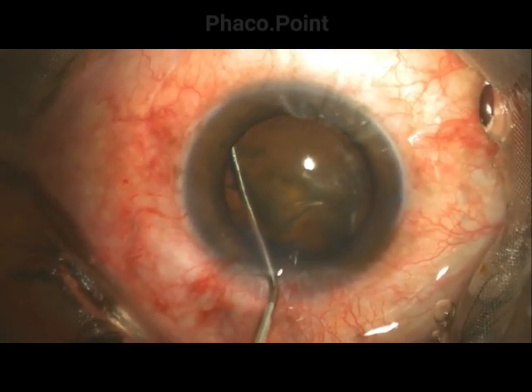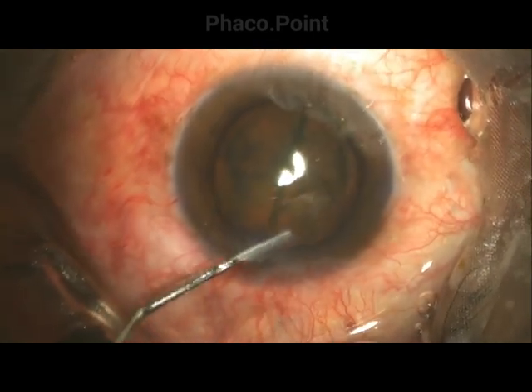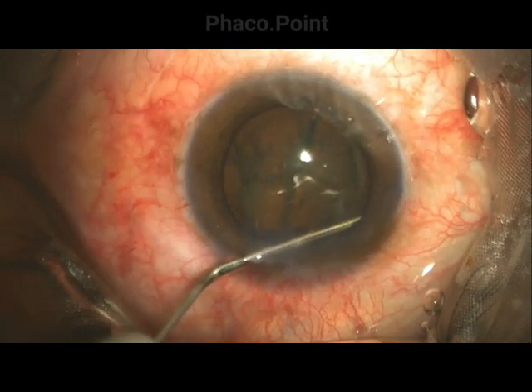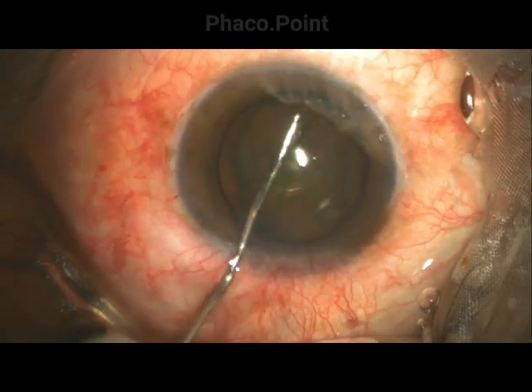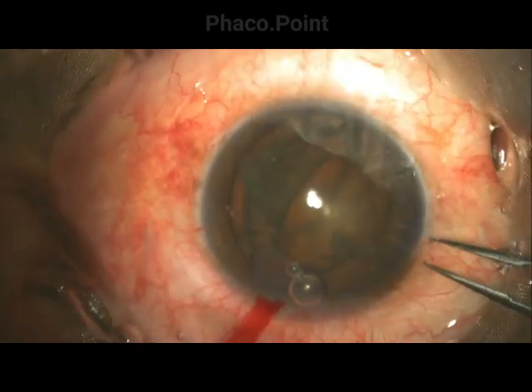It is elevated before injecting a sharp jet of fluid — note how the nucleus rises. Once decompressed, the same procedure is carried out at another clock hour. Once completed, the surgeon introduces viscoelastic to deepen the anterior chamber and then proceeds to rotating the lens.